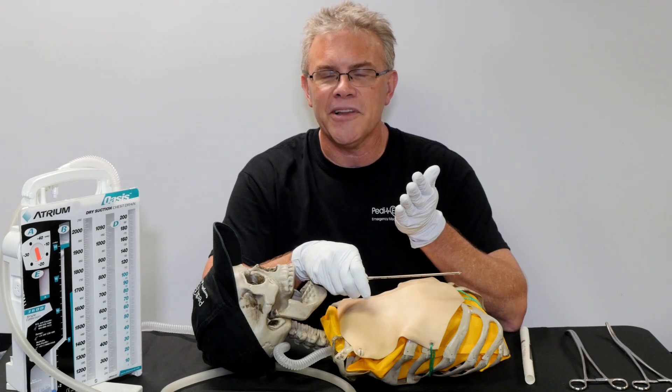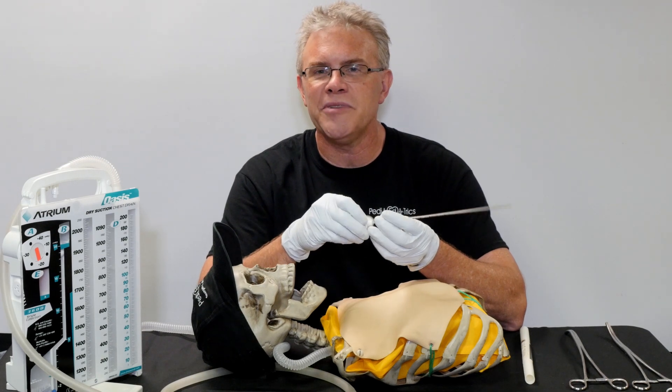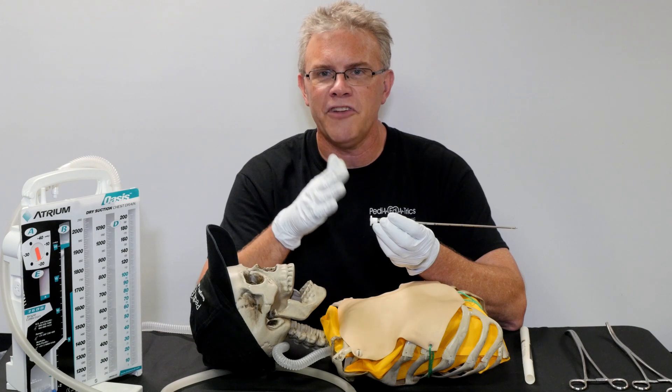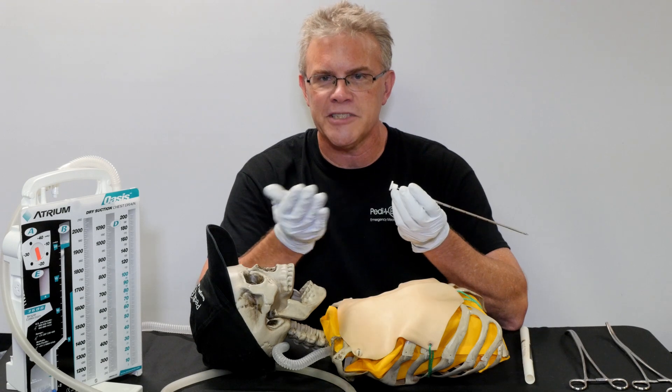However, happily, times are changing. For several years now, they do not recommend trocars anymore. We typically use a finger and your scalpel and do what we need to do, plus or minus a set of hemostats.